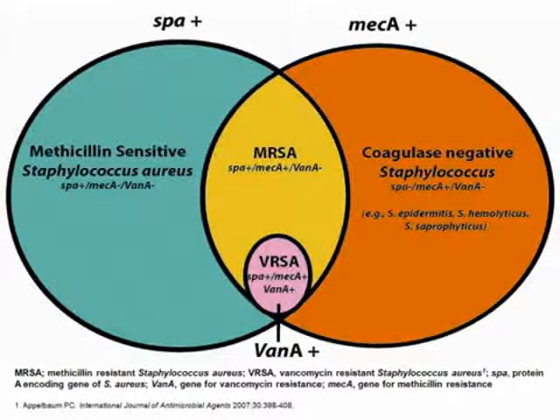The Van-A positive circle represents staph strains carrying the gene for vancomycin resistance. A nucleic acid recognition device should be able to detect all strains of Staph aureus, including resistant strains such as vancomycin-resistant Staph aureus, also known as VRSA, and methicillin-resistant Staph aureus, or MRSA. This means that the assay should detect all species represented in the entire left circle. This encompasses the green, yellow, and pink portions. The assay should not detect any related neighboring species, such as those listed in the right orange portion.